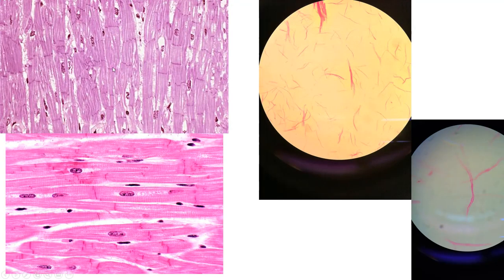This is cardiac muscle. You should also be able to see striations, which you can see right here. But the big thing about cardiac muscle is you also get these things called intercalated discs. These are a combination of gap junctions and desmosomes that allow the cells to rapidly communicate with each other. So intercalated disc, intercalated disc.